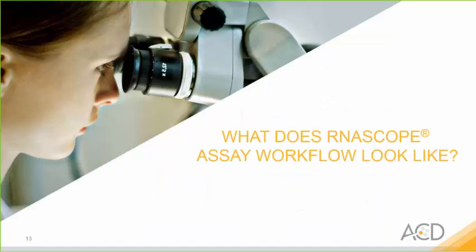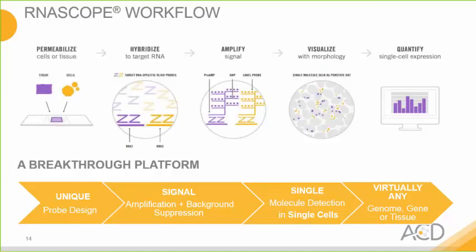Okay, so going back to the RNA assay workflow, what does it look like? Going back to this slide, on a very high level, it's very similar to IHC. The RNAscope assay starts with permeabilized, properly prepared, and fixed tissue with RNAscope pretreatment reagent to allow the target probe to penetrate into the cell and bind to the target sequence. The specific sequence is recognized by the double Z pair, then gets amplified through the amplification cascade.